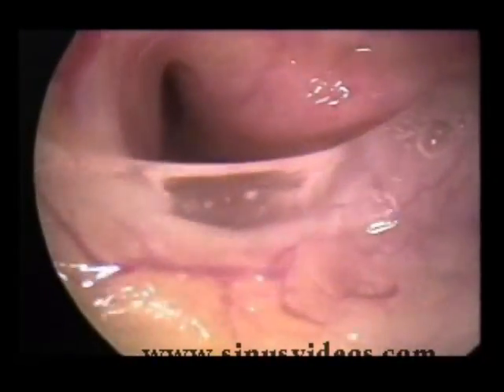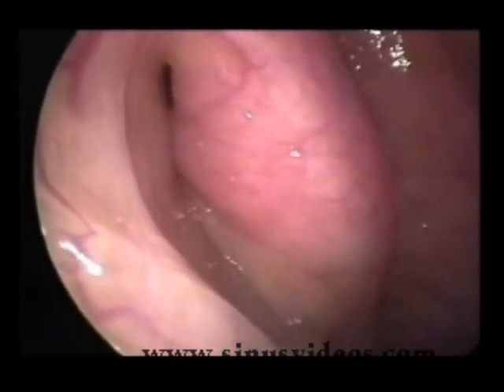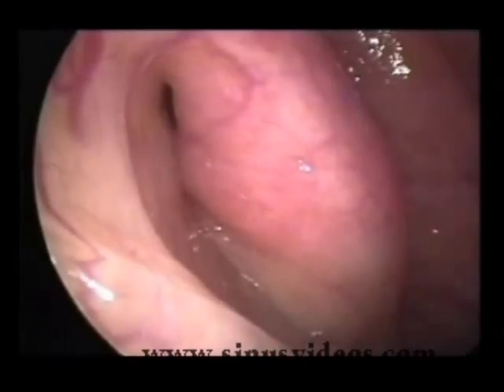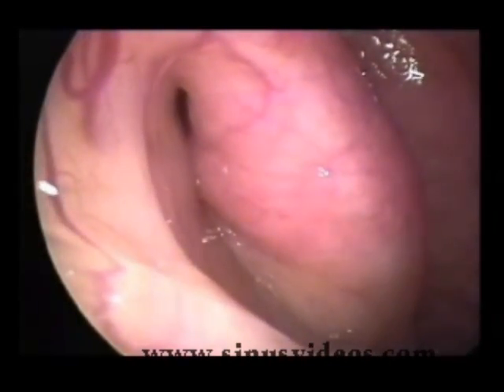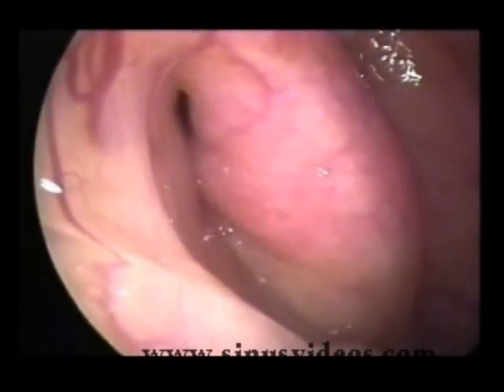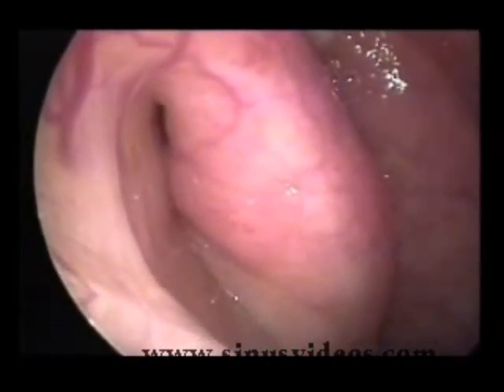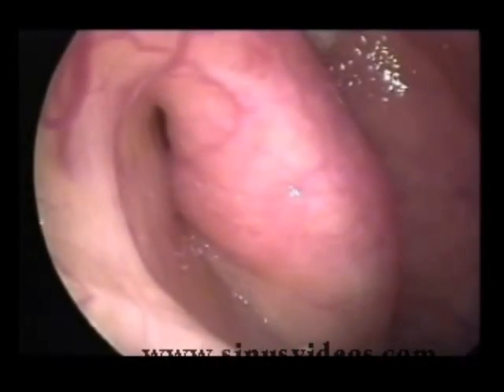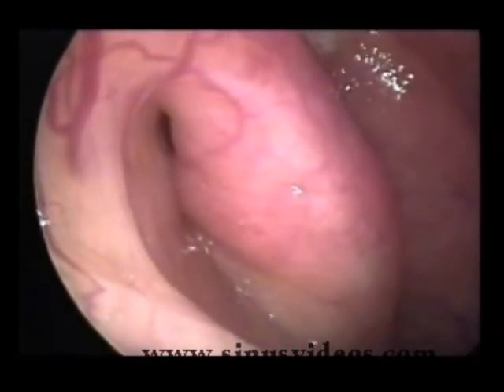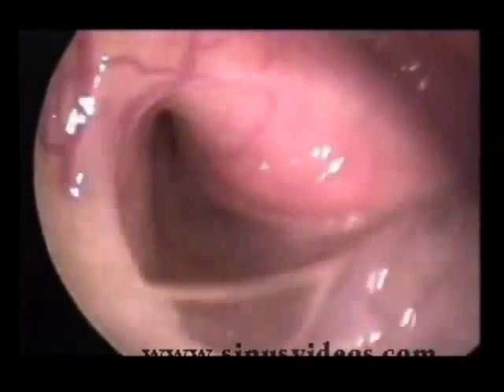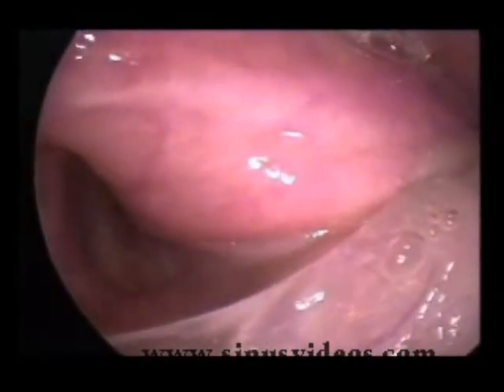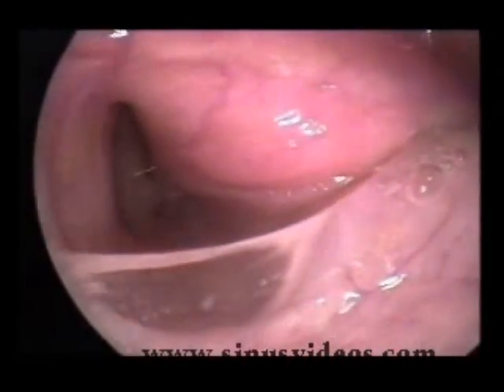This is a patulous eustachian tube on the right side. We see on the lateral wall or anterior wall an area which is normally convex superiorly, and yet in this patient it is completely concave along the length of the eustachian tube, causing the aeration defect.